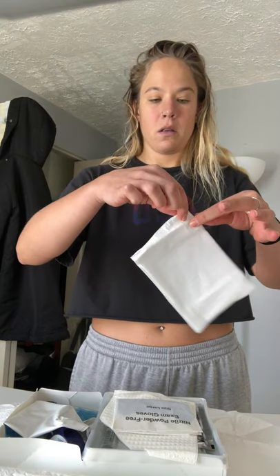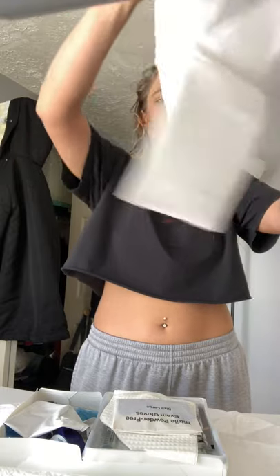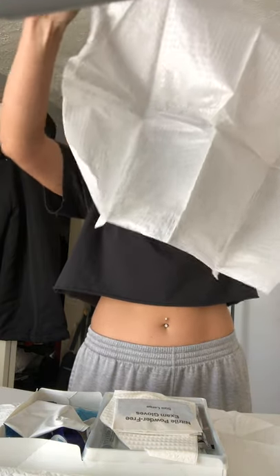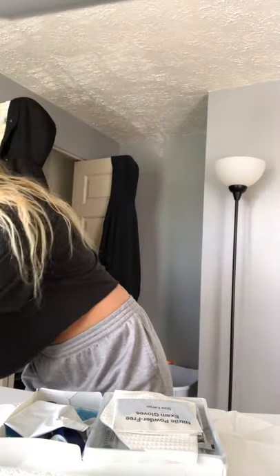So this is going to be the sterile field. I want to open this up, only touching the one inch border — the center being the most sterile. This is what's going to go right underneath the patient, but I'm just going to set it to the side right here.